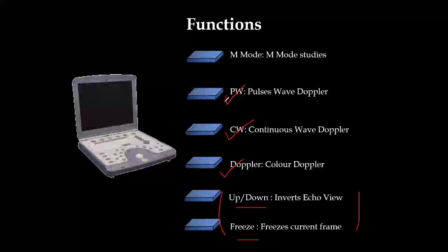Yes. So good. So for measuring all types of velocities, you should use the pulse wave Doppler. Pulse wave Doppler measures all types of velocities up to the peak systolic velocity, as long as the peak velocity is less than 2 meters per second.